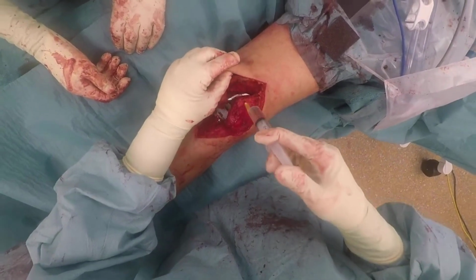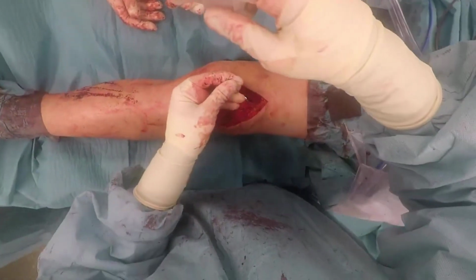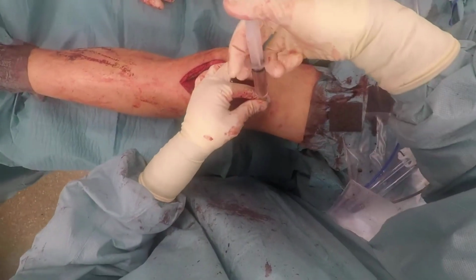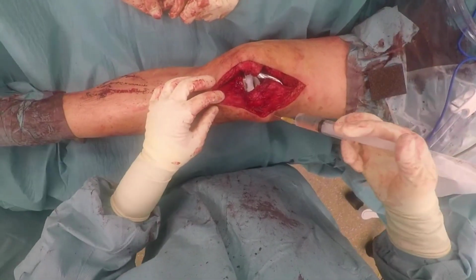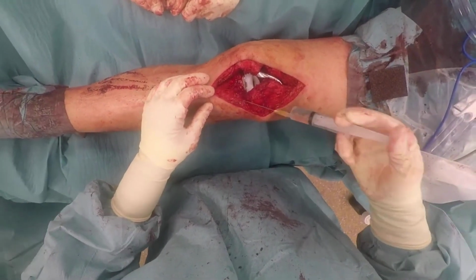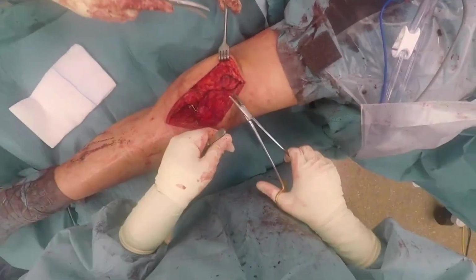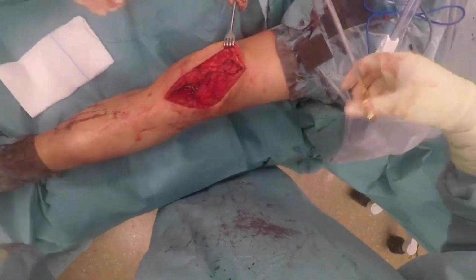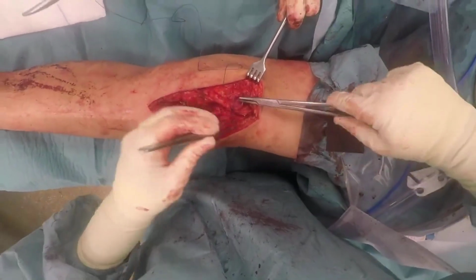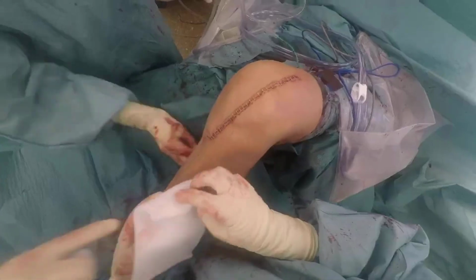Before closing the surgical wound, we apply our local pain relief protocol to both the deep and superficial layers, which will ensure excellent pain coverage. Which is generally very well tolerated, despite what you may think when you see these images. The last stage of the surgery is to close the capsule first and then the layer under the skin, using a resorbable suture. The skin will be closed with metal staples, which will be removed after 2 weeks.